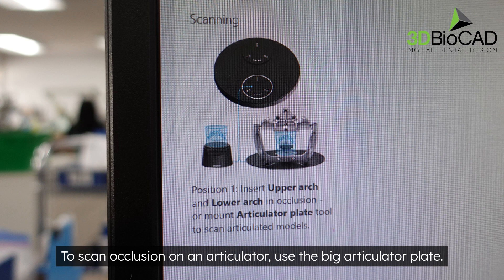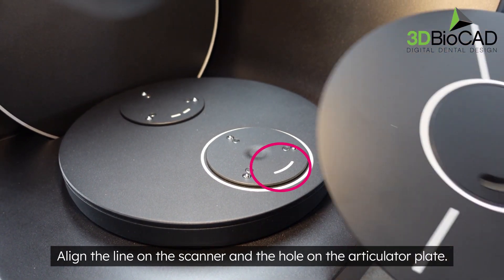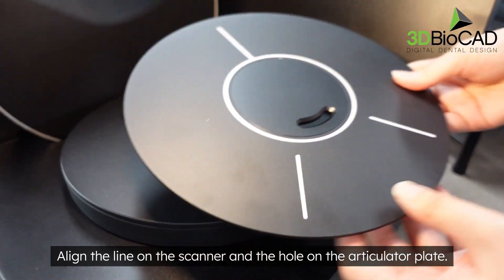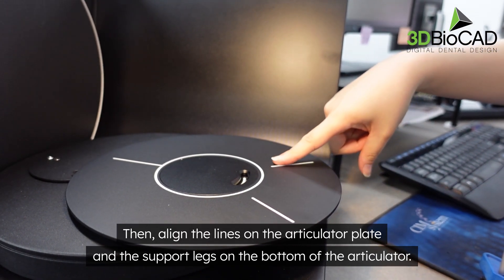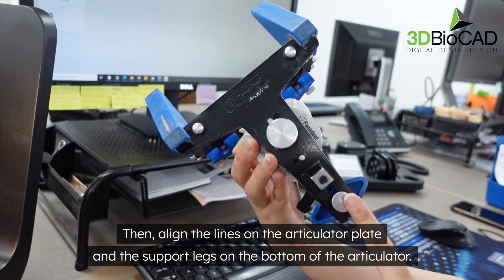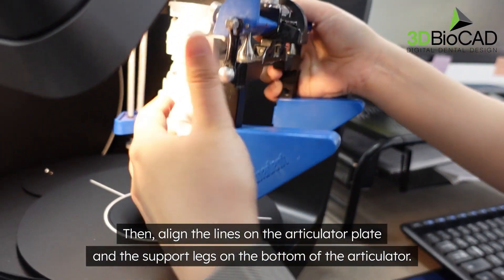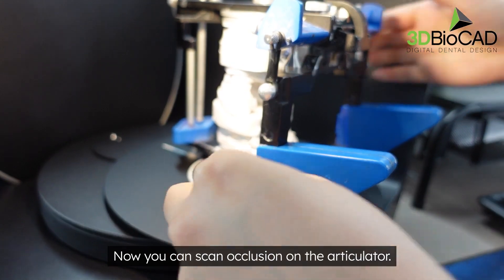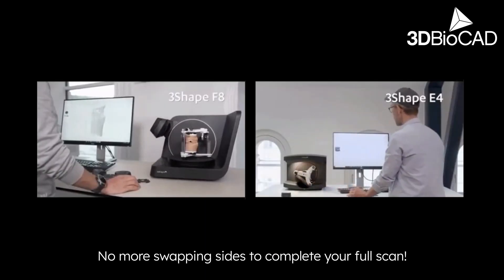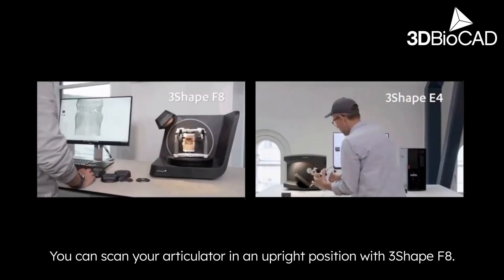To scan occlusion on an articulator, use the big articulator plate. Align the line on the scanner with the hole on the articulator plate, then align the lines on the articulator plate with the support legs on the bottom of the articulator. Now you can scan occlusion on the articulator — no more swapping sides to complete your full scan. You can scan your articulator in an upright position with the 3Shape F8.